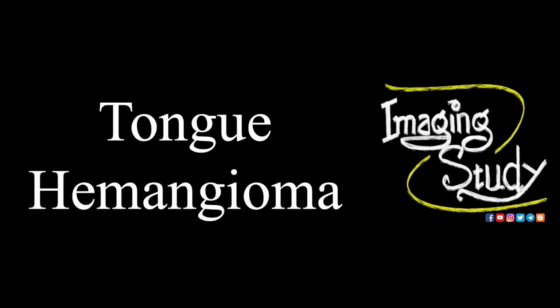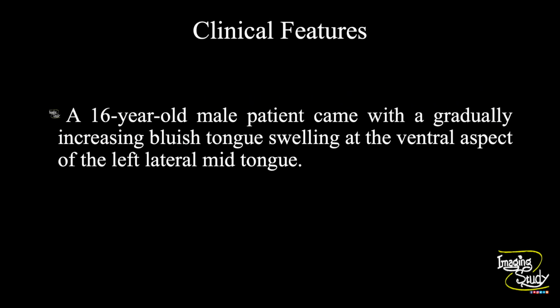Today we are going to see a case of tongue hemangioma. A 16-year-old male patient came with a gradually increasing bluish tongue swelling at the ventral aspect of the left lateral mid-tongue. Let's see what we have got on ultrasound.